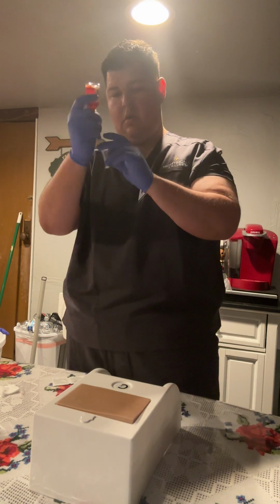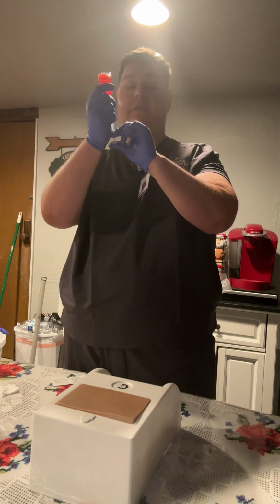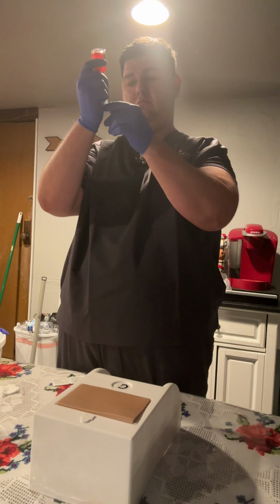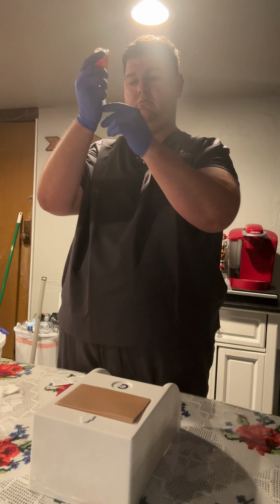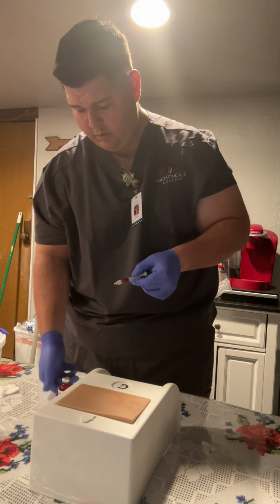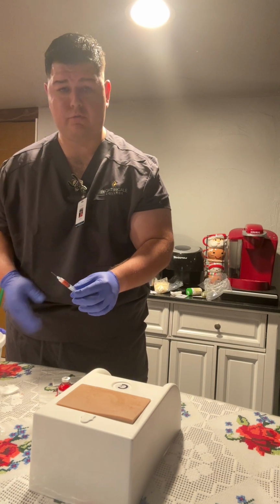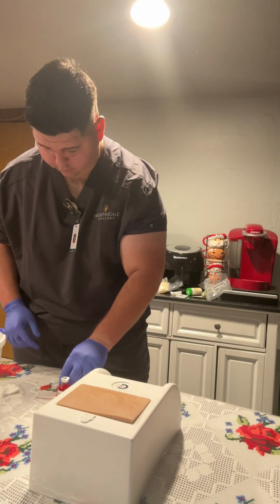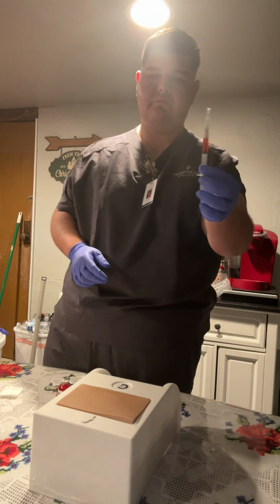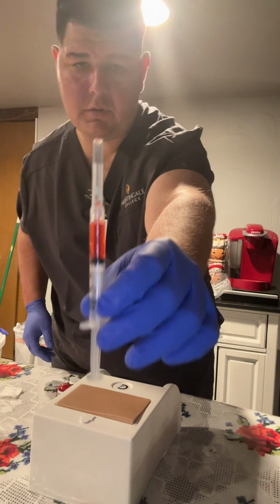Oop. Nope, there's air. I'll push that all back in and attempt my redraw again. Get the air out of the vial. All right, 1.5. And I will cap my syringe, my whole needle, using the swoop method. All right, it's on. My syringe is capped. My medicine's ready. 1.5 milliliters.